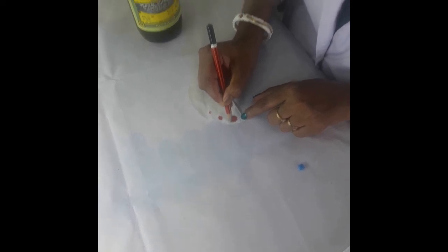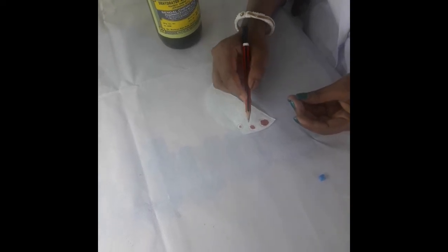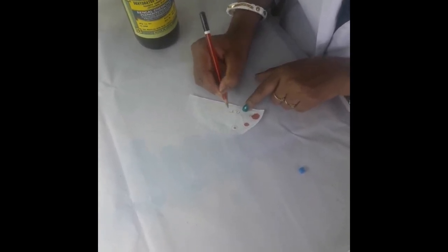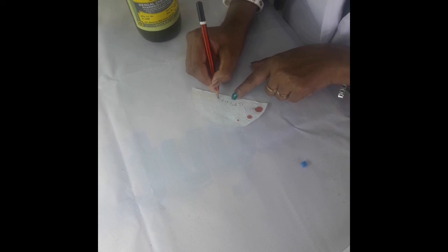The first spot follows after 30 seconds of pricking the finger. Then we record bleeding time: finger prick, 30 seconds, 30 seconds. Bleeding time BT equals 1 and a half minutes.